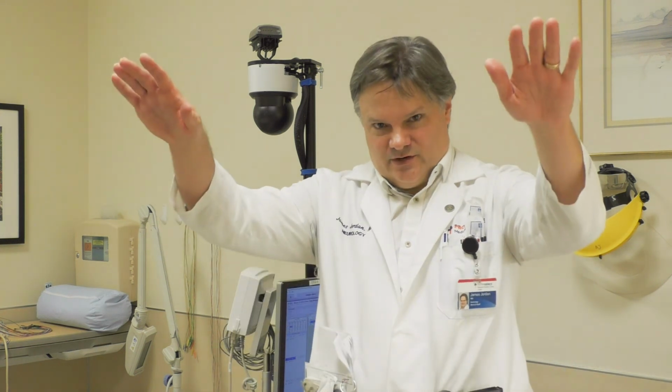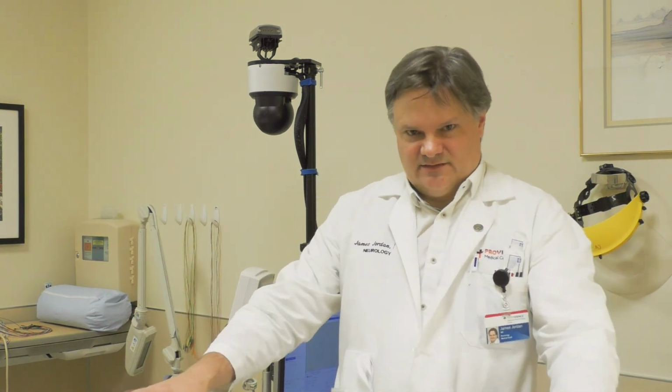Test motor again. Probably good to do legs as well to see if there's any focal weakness anywhere. If family's there, or if the patient didn't lose consciousness for the seizure, it might be a good idea to verify that this was one of their typical seizures or events. Some people have multiple seizures. We want to try to make sure we capture all of their events that we're trying to figure out if they're even seizures or not.